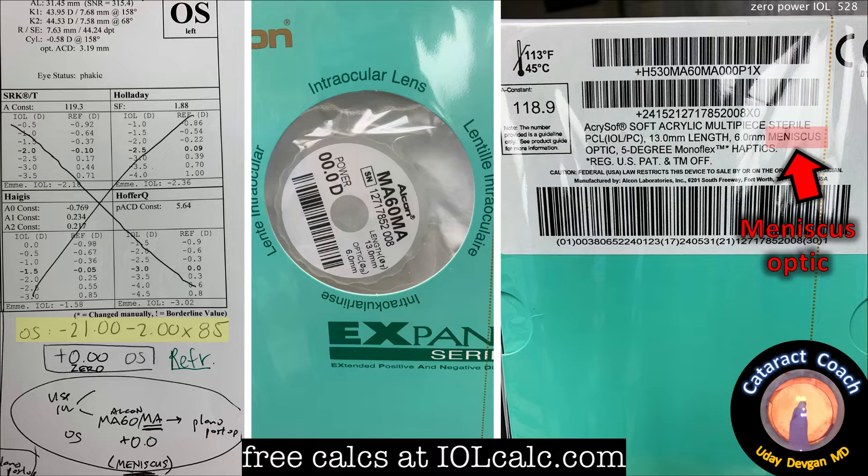There it is in the middle frame — the zero-power lens. And look at the right side of the screen. Notice that it says on the box it's a meniscus optic, and the calculations are going to be different for this as compared to the traditional bi-convex optic. We've covered that topic before here on Cataract Coach. So now we know for sure we're implanting a zero-power lens.